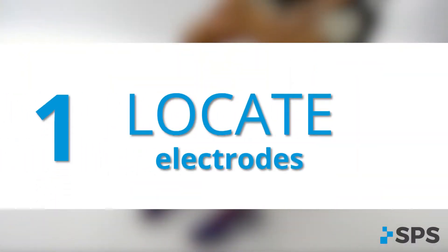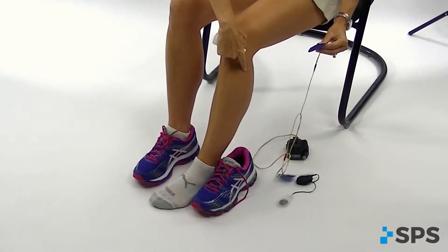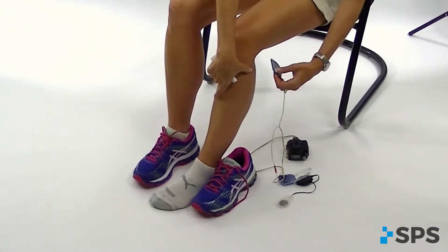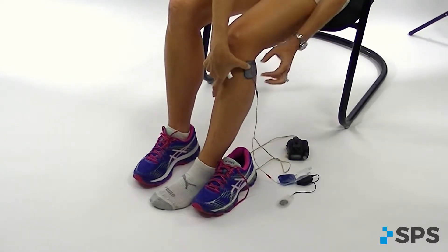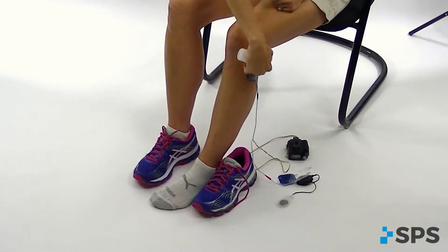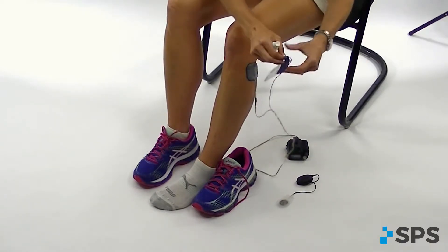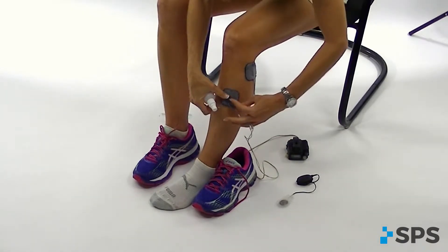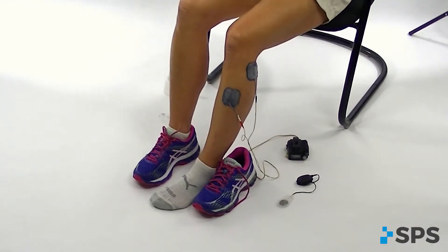I'm going to show you our standard electrode placement option here. With drop foot, the black lead is our active lead. I'm going to find the fibular head. I want my electrode to capture that nerve and the bifurcation. The front upper quadrant of the electrode is going to be over the fibular head — it's hard underneath that front upper quadrant and soft behind and beneath it. The red electrode lead is our inactive; I'm going to position this right over the anterior tib, and now our electrode placement is ready to go.